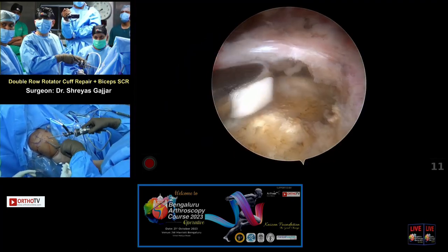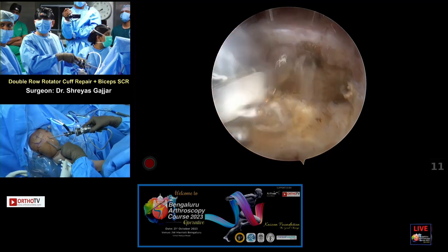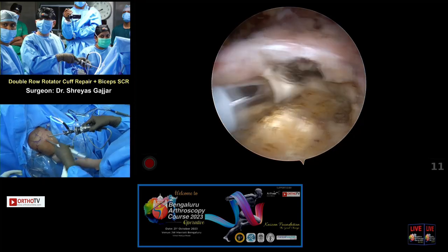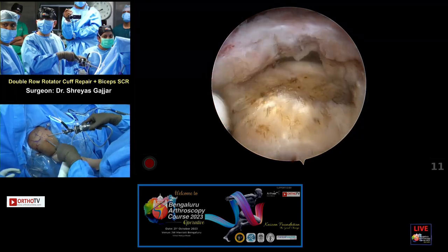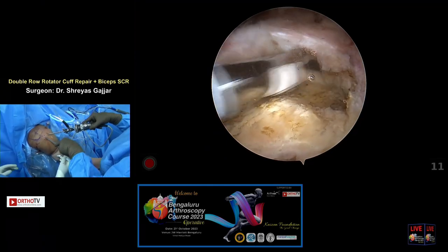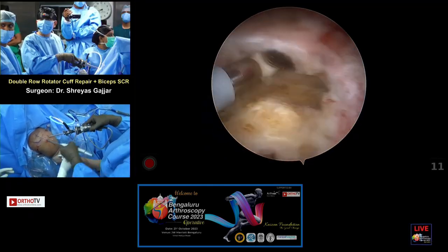I mean, you can do a single row here, but for demonstration purposes, and also this is a small to medium tear. So, you know, you can argue single row, double row, but for demonstration, I'm just going to do a double row because I think I have the space.